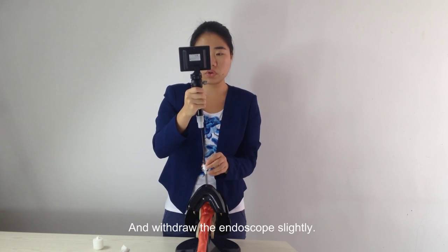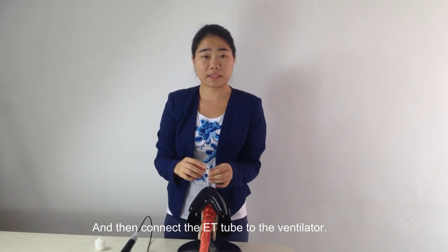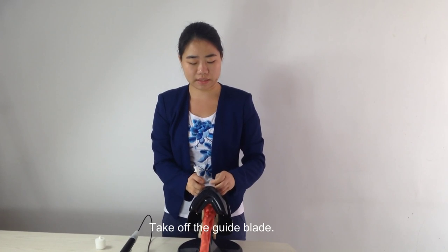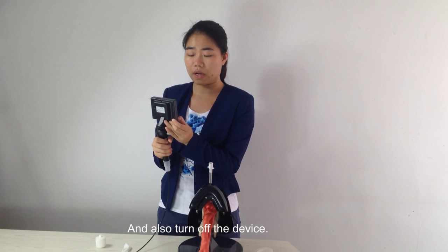Withdraw the endoscope slightly. Then connect the ET tube to the ventilator. Take off the guide blade, and turn off the device.